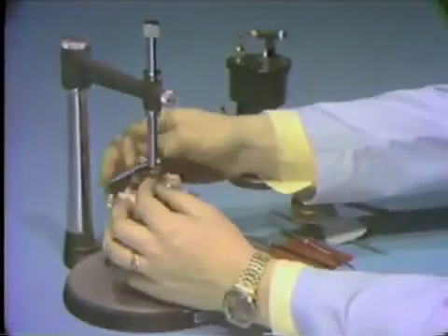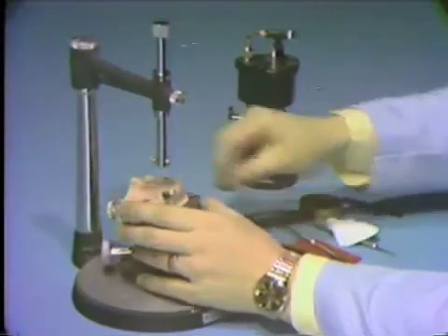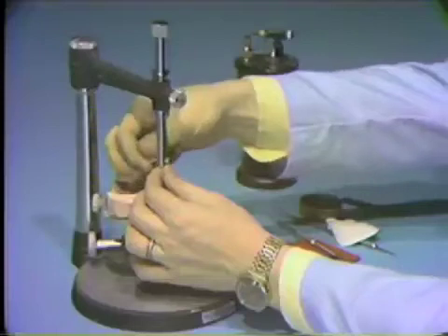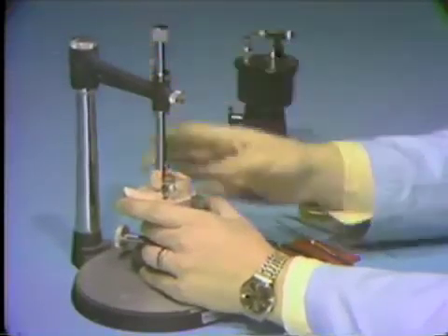The contact of the survey rod with the powdered wax crown should delineate the survey line fairly accurately. Place the 20 thousandths of an inch undercut gauge in the surveyor spindle and check to be sure you have created a retentive area of 20 thousandths of an inch in the mesial distal center of the buccal surface and in the cervical one-third of the tooth. The shaft and the flange of the undercut gauge must touch at the same time to indicate this undercut.